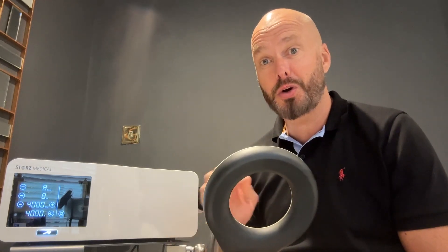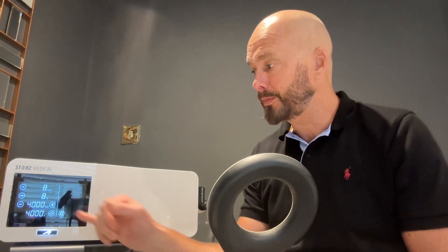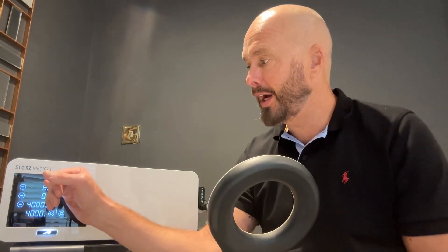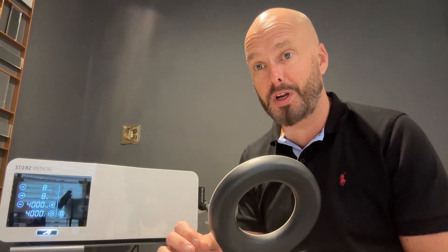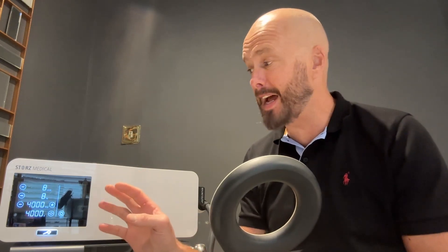It will cancel those things quicker than you can say EMTT. Here we've got the settings. I tend to treat on level 8, 8 hertz and 4000 shocks per treatment. This is pretty much standardised.